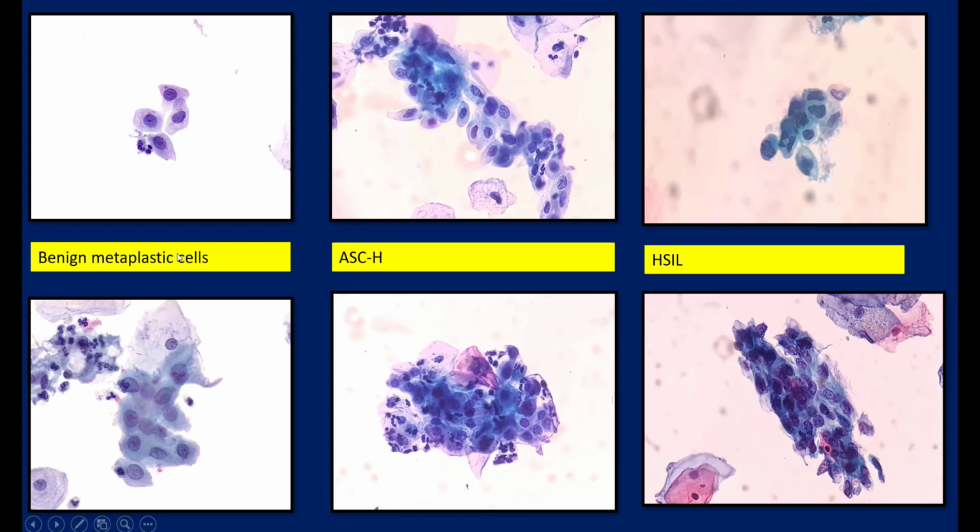You can have a little bit of hyperchromasia in benign metaplastic cell clusters, pretty well oriented with each other. You can have some kind of intercellular windows between these cells, and sometimes a slightly bigger cluster with a more opened up chromatin, very sharp nuclear outline. You may find a little bit of nuclear membrane irregularity in one or two of the cells, which shouldn't immediately trigger a diagnosis of ASC-H or HSIL.